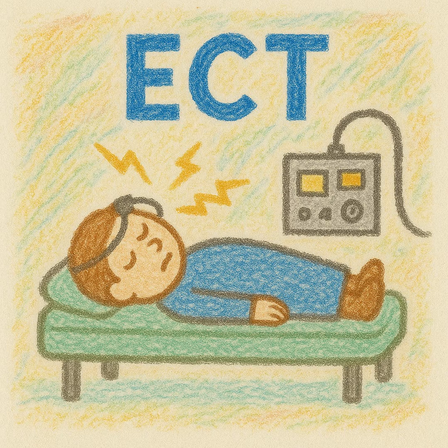So the main ones are, well, let me back up and just have you try to imagine what the machine is doing. So the machine is delivering these kind of square wave pulses, and they're bidirectional pulses. So the current is going in two different directions. So it's like an alternating current that is pulsatile. And so each pulse of the current has a width, basically the duration of the pulse, and we call that the pulse width. And that can vary anywhere from about 0.25 milliseconds to, say, 2.0 milliseconds.